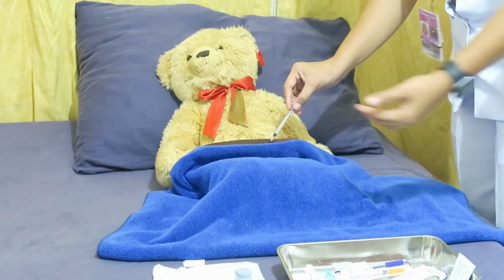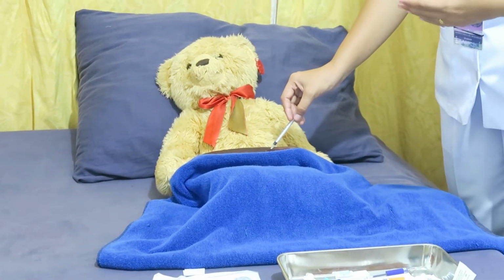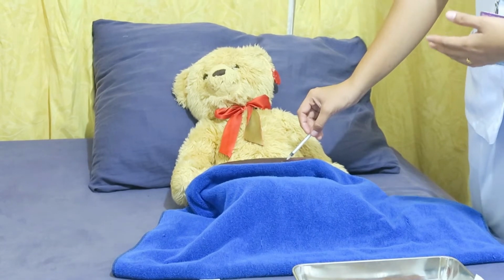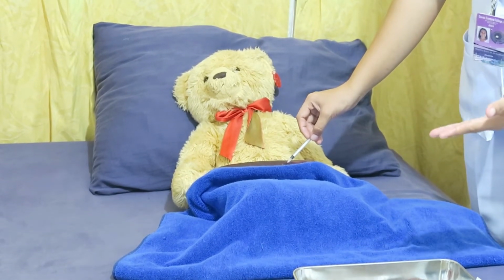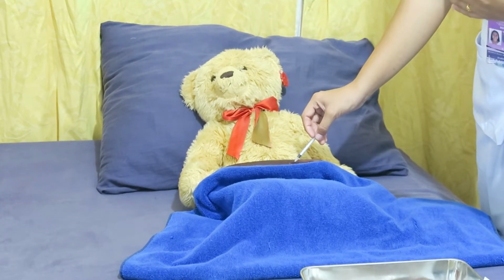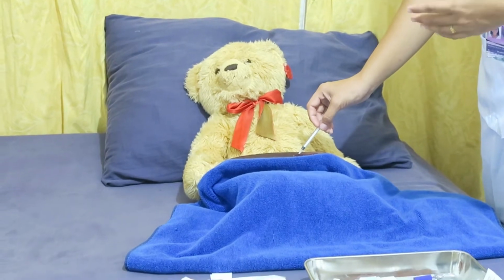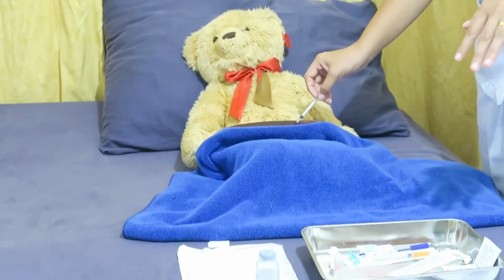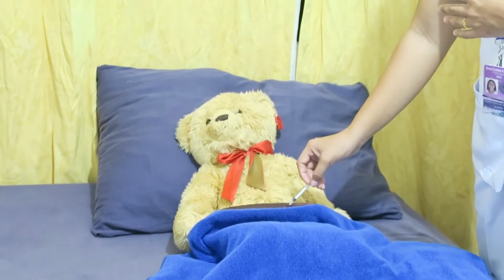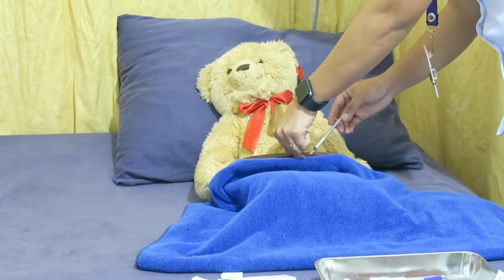Then, after that, remove the needle smoothly, pulling along the line of insertion while depressing the skin with your non-dominant hand. The rationale for that is that depressing the skin provides counter traction and minimizes the patient's discomfort when the needle is withdrawn. Massaging the area may interfere with test results by spreading the medication to subcutaneous tissue. So let's withdraw the needle.